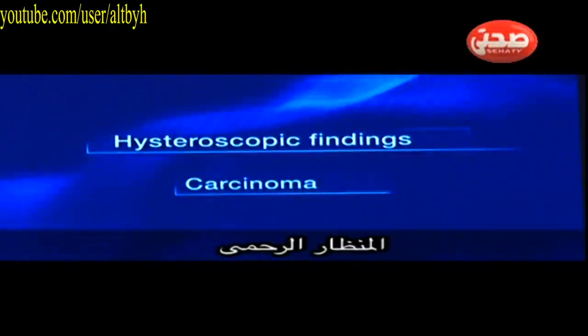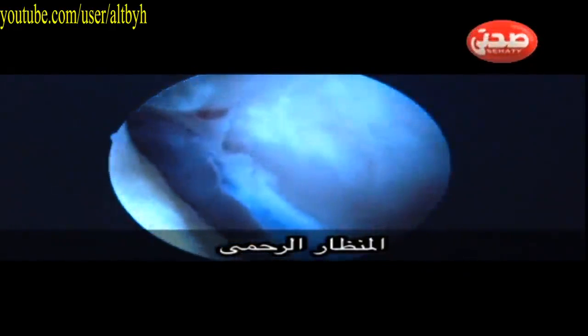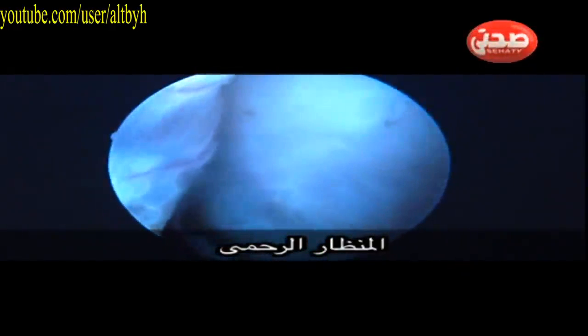Carcinoma is one of the very important pathologies which we always suspect in postmenopausal patients, especially if the endometrial thickness is more than 5 millimeters. In this case, hysteroscopy was done for a lady with postmenopausal bleeding, and a malignancy was suspected. As you can see, the endometrium looks abnormal with high suspicion of malignancy, with neovascularization and abnormal vasculature.